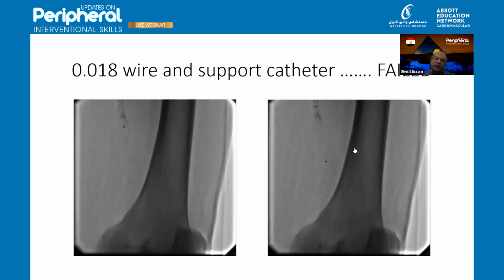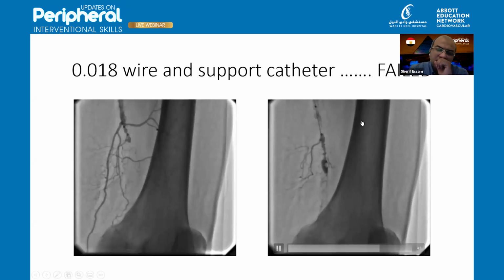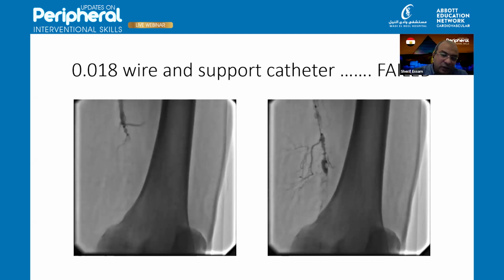Now, after doing the dilatation, we'll get back again to the common femoral. After doing the dilatation, I'll show the post-balloon angio for the common femoral. But just to continue, to know the anatomical tree, how was it like?